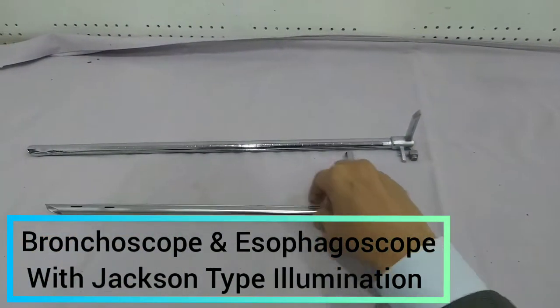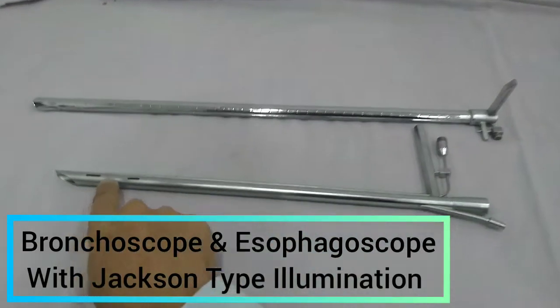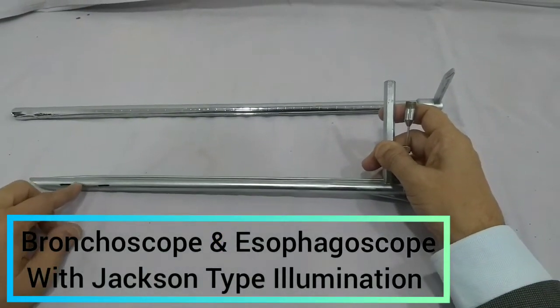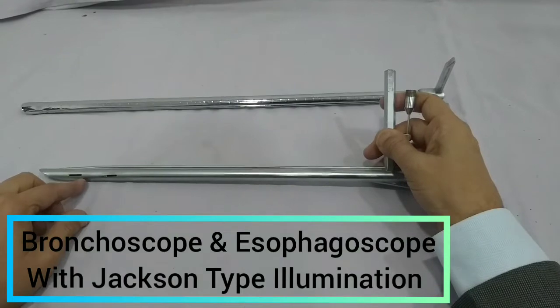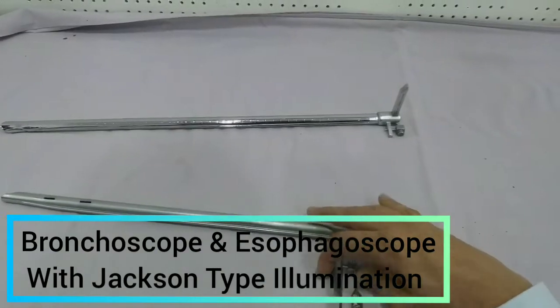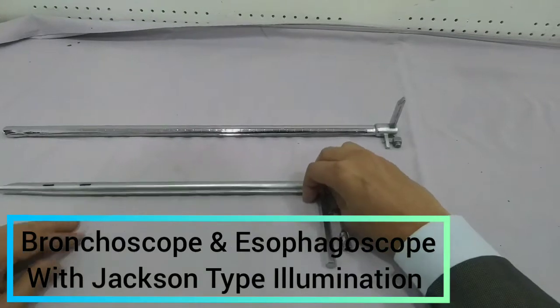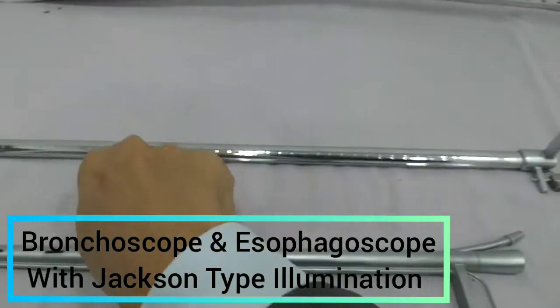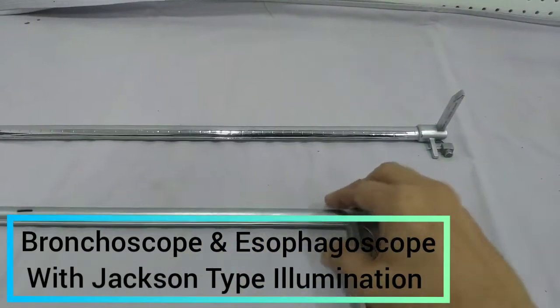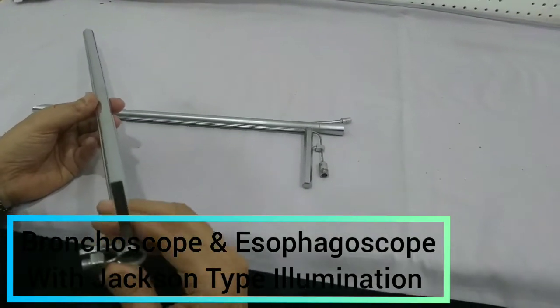You can see the main difference between the esophagoscope and the bronchoscope is these vents, these openings. These vents will provide ventilation through the bronchoscope when it is inserted. This is your point of ventilation. Another difference you can see on the esophagoscope is this marking, which shows how deep the lesion, foreign body, or ulcer is located.